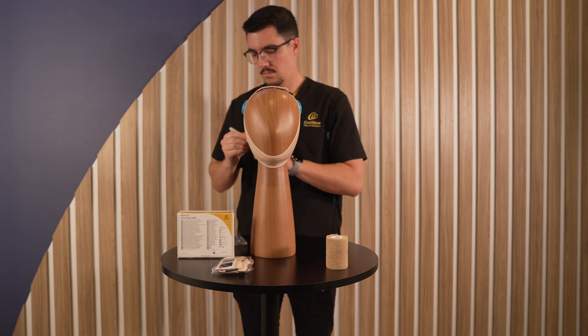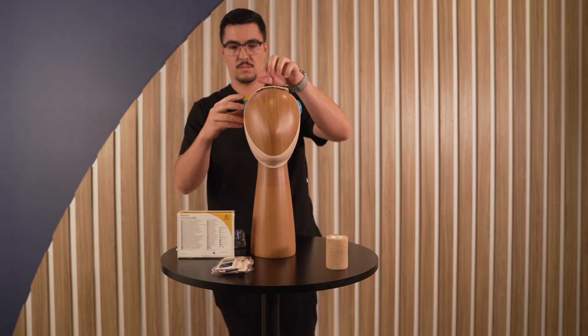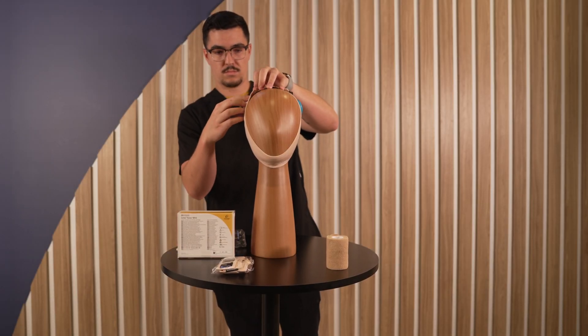Repeat if bilateral. Note: the 600 series and the OSI 300 series do not need an MRI kit applied. Insert the round splint under the chin strap directly under the drawn markings.